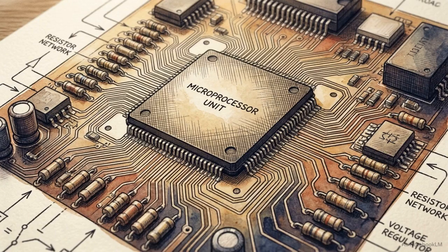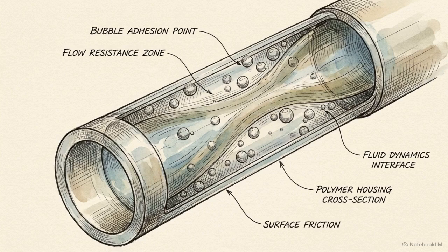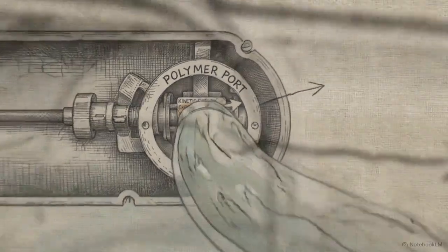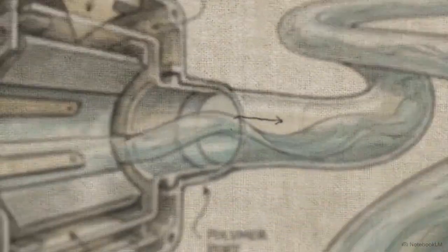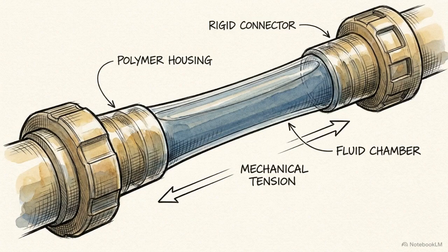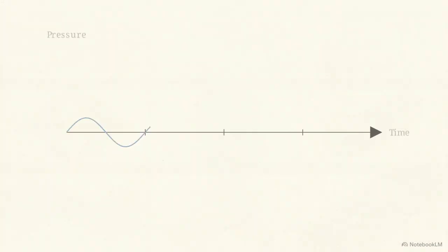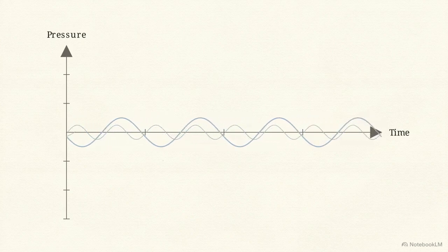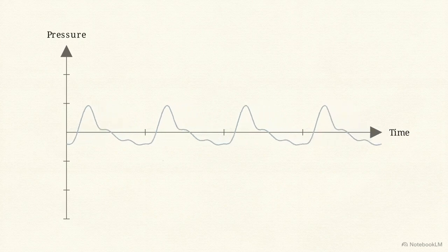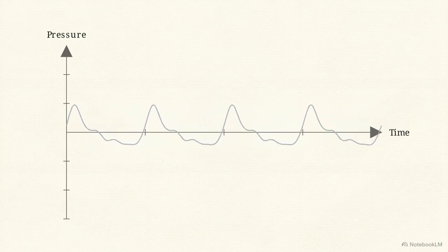When a clinical waveform distorts, the failure is almost never electrical. It lies upstream in the fluid mechanics. We step backward, out of the transducer, and into the column of saline tubing connecting the sensor to the patient. Every physical system possesses a natural frequency, the inherent preferred rate at which it will oscillate when disturbed. The fundamental frequency of the human arterial pulse is low, between 1 and 3 Hz, but it is built from multiple higher-frequency harmonic waves stacked together.